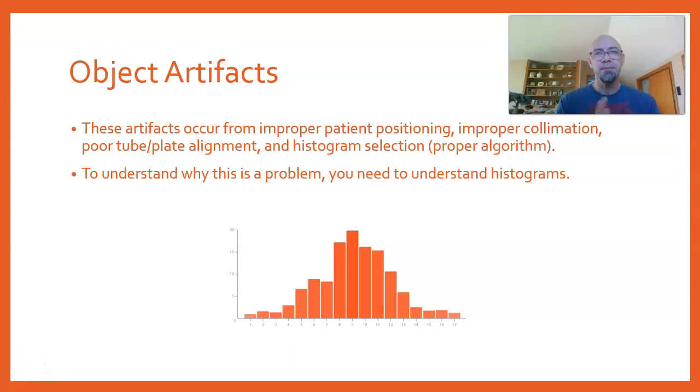All right, histogram. So let's start off by pretending we're in lab and we have to make tags for our next exam. Let's pretend we're going to be doing an elbow x-ray. So that means we have to set up our elbow exams or our elbow images in the control panel. So we go to the control panel, we hit add exam or add views. We're going to go to primary category, upper extremity, and then we're going to hit elbow, and then there's probably AP, oblique, oblique, and lateral, right? Now, there's a reason why you do that. There's a reason why you're picking specifically which views you're going to do.